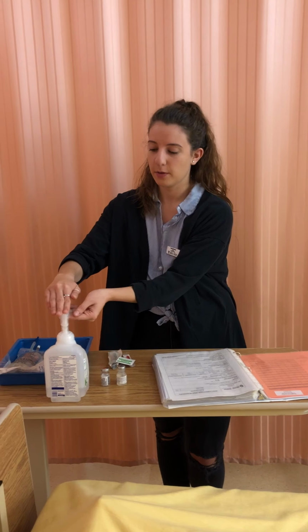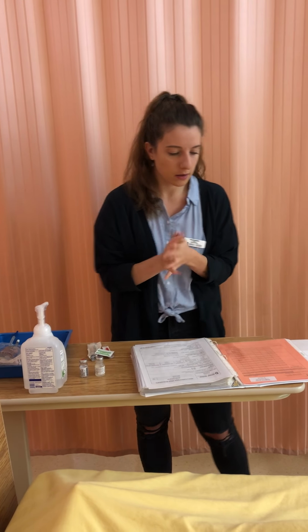Hi, my name is Paulina, and today I'll be reconstituting a drug and administering it via minibag. So I'm just going to perform hand hygiene here and go over my MAR.